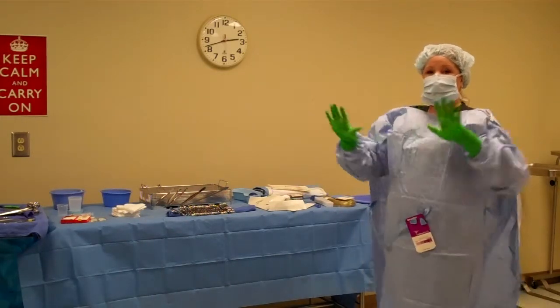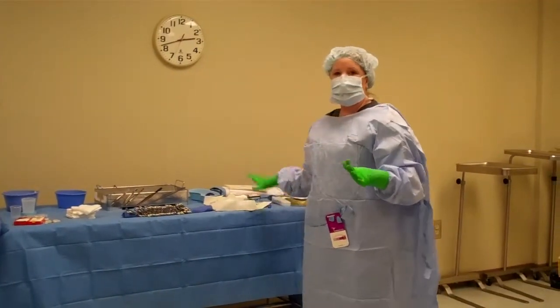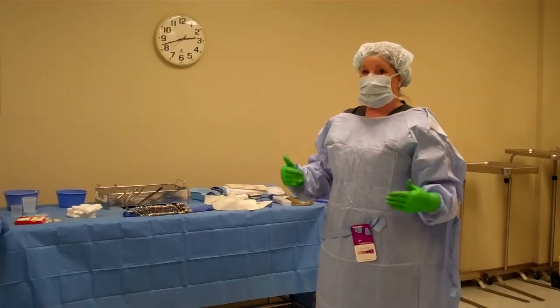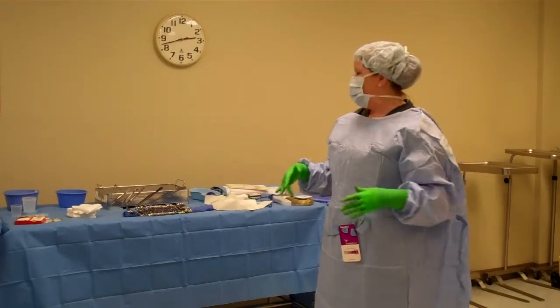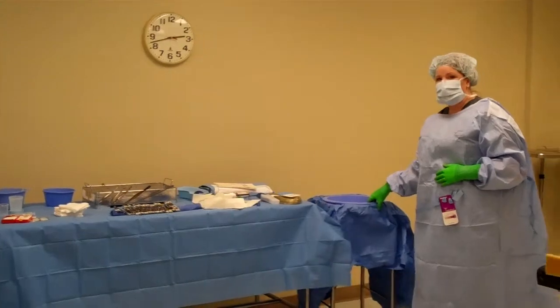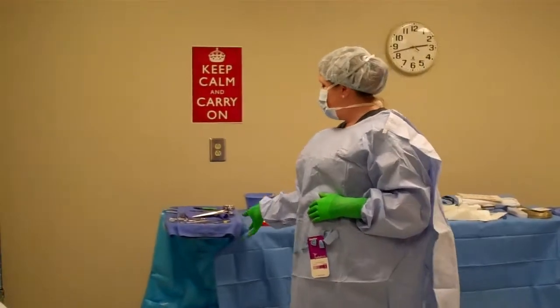Now, I am considered sterile right now, so I can touch all this blue. Once you're blue, you can touch anything else that's blue. If you're not blue, do not touch anything that is blue, okay? So this is my sterile table. This is my ring stand. You may see these. And this is my Mayo.